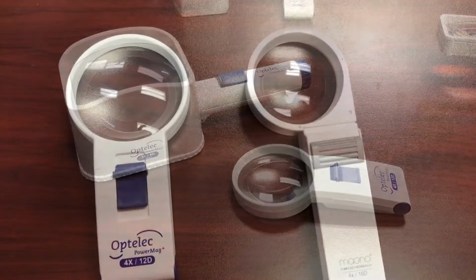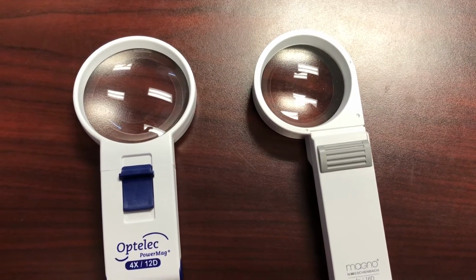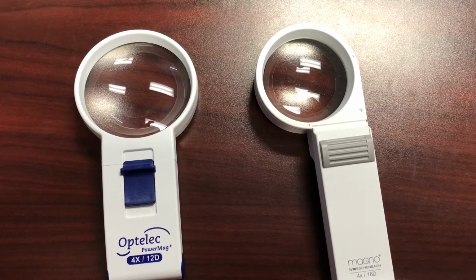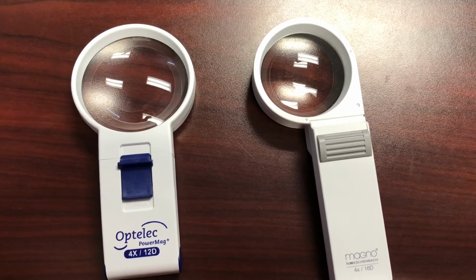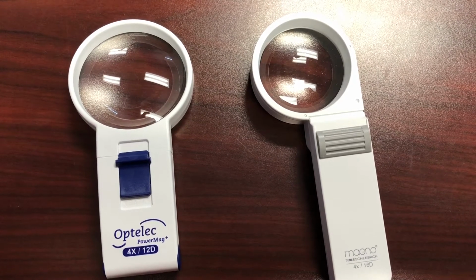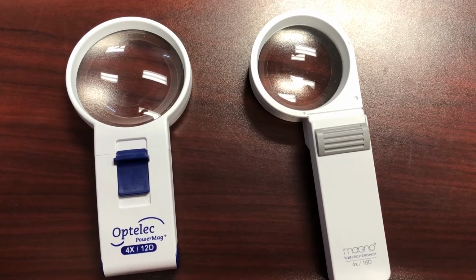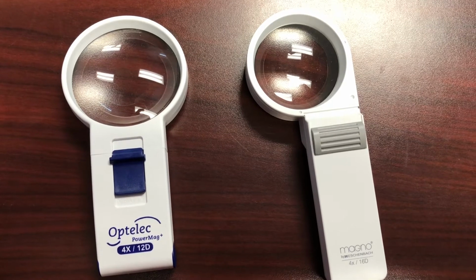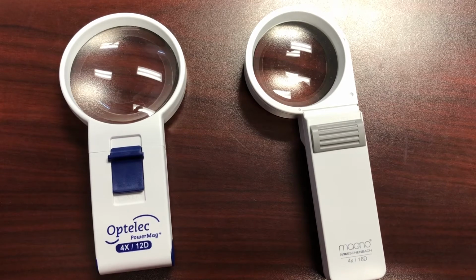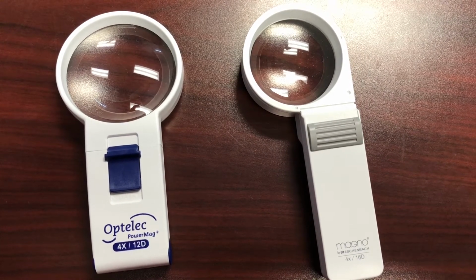Now, as we compare these magnifiers today, it's not really comparing apples to apples because manufacturers report the power of magnification a little bit differently. On the left, the Powermag Optelec magnifier states that it's 4x, or 4 times magnification, but you'll note that it says 12D next to that. That means 12 diopters. Whereas on the right, the 4x handheld Eschenbach Magno says that it's 4x as well, but it notes that it's 16 diopters.